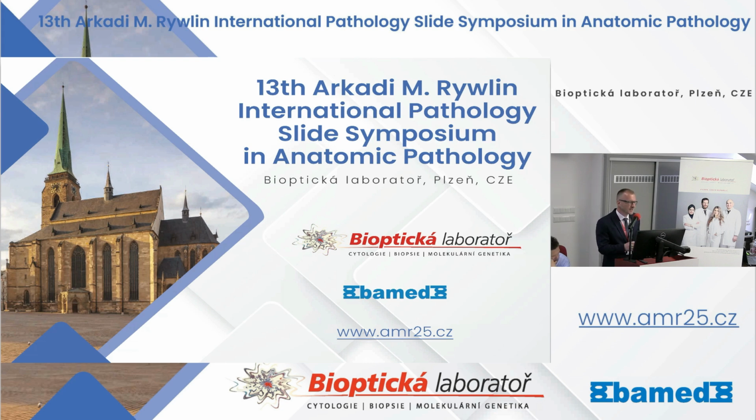AI is something like immunohistochemistry, and would you say it's a positive immunohistochemistry just through windows? You can sometimes see just black, yeah, definitely positive, but would you do it anyway? Just look like that, and yeah, positive. So, it's the same in AI. Yes, it will help you, but it's not the system that makes the diagnosis, never. Thank you.